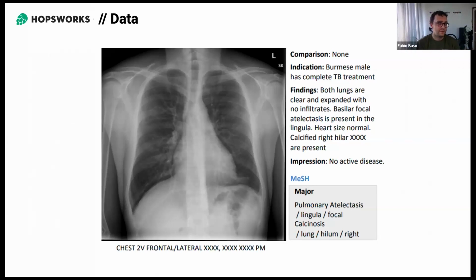There are obviously some images of people who are completely healthy. In the second step, we want to be able to query this knowledge using a chatbot built leveraging things like large language models and function calling.